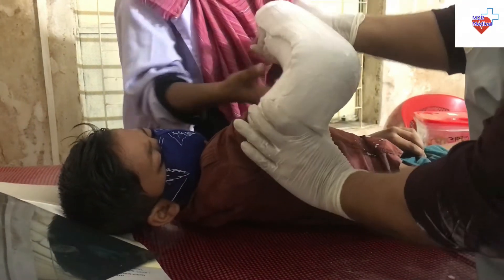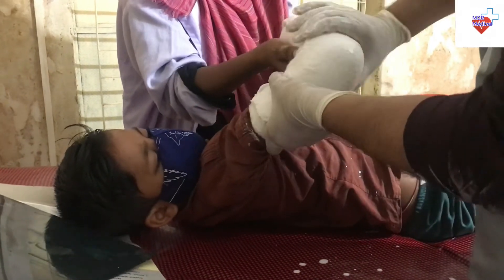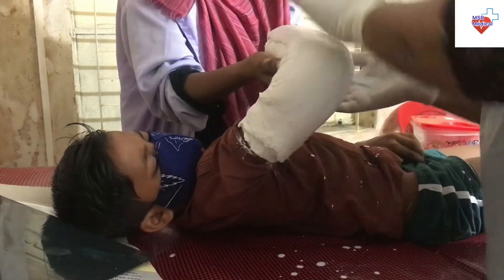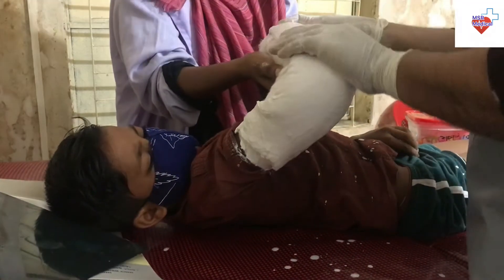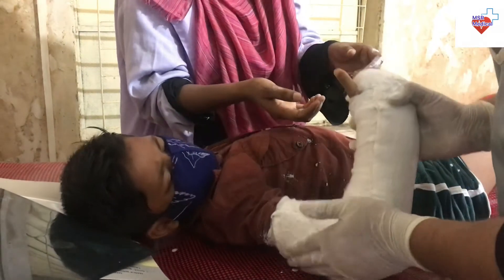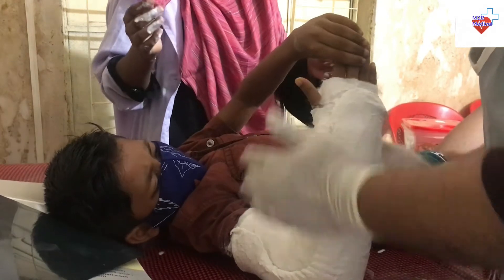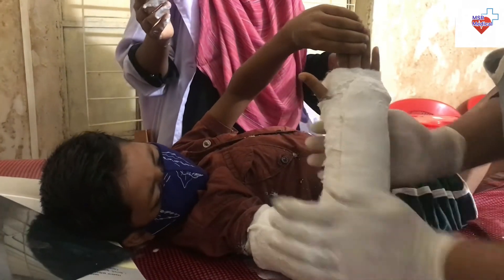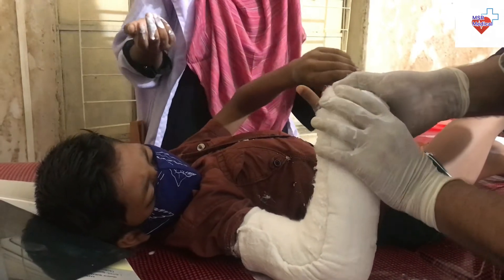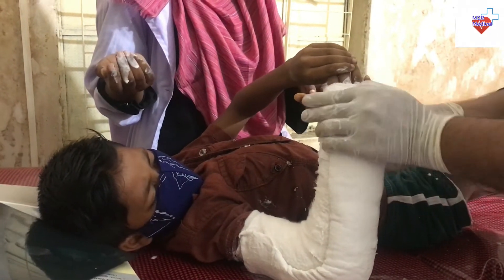Wet the unfolded 3-inch plaster slab and apply along the posterior aspect of the arm and ulnar aspect of the forearm. Fold over any excess plaster to ensure it does not overhang the soft roll, and smooth the plaster to adhere to the underlying soft roll. Overwrap the plaster with flannel from proximal to the elbow. It is not necessary to overwrap the full length of plaster at this point.